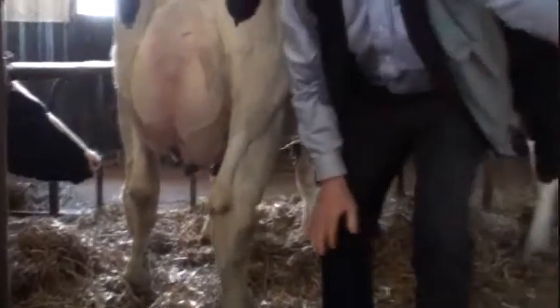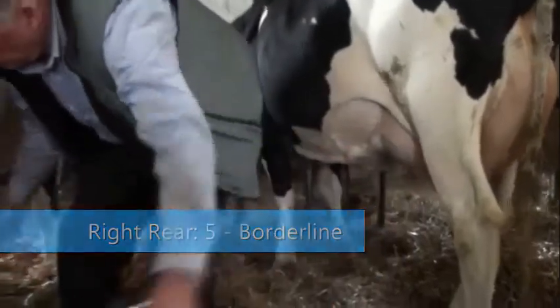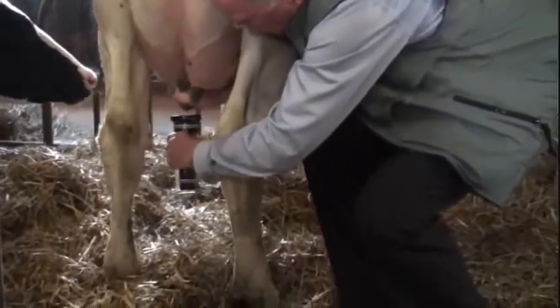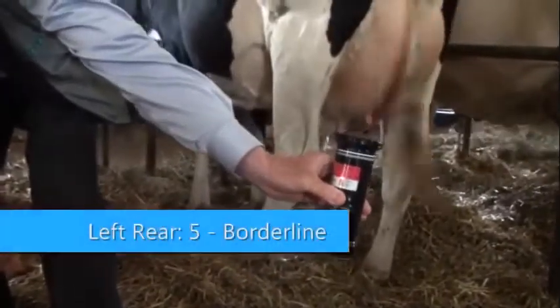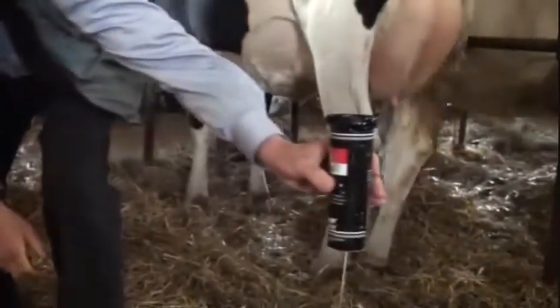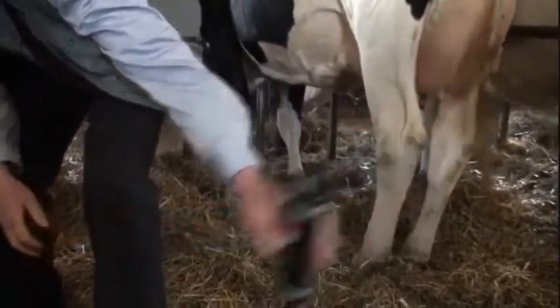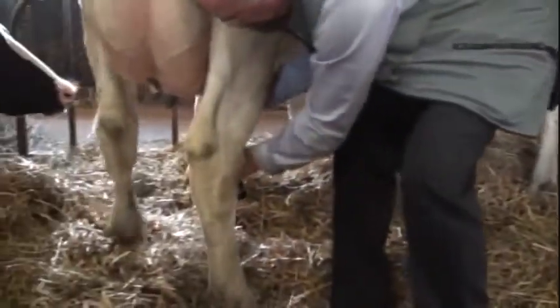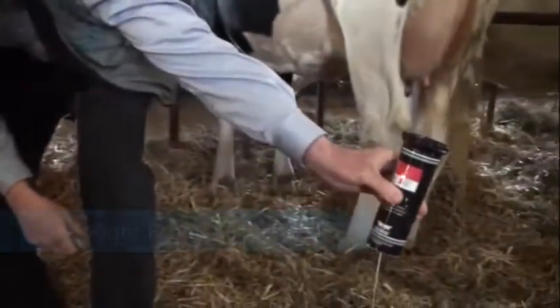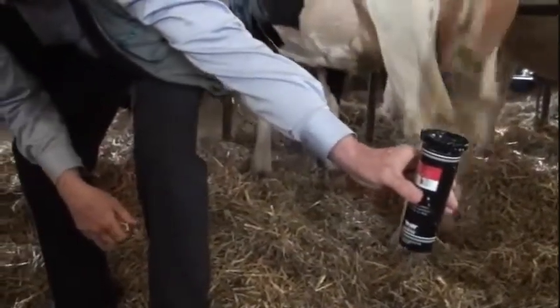So now I'll proceed here to use this instrument and show you how it works. That's the right rear. Now we've got the left rear. Now we've got the right front and left front. So the left front indicates the major part of the problem in this cow.